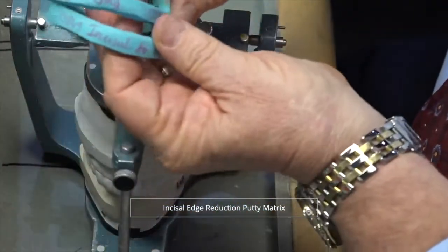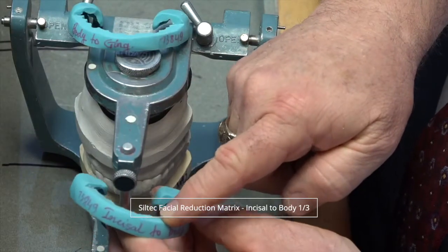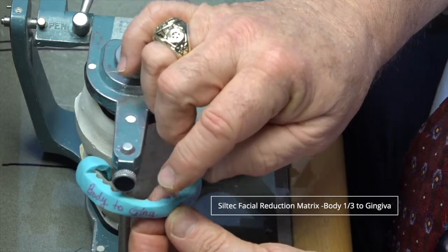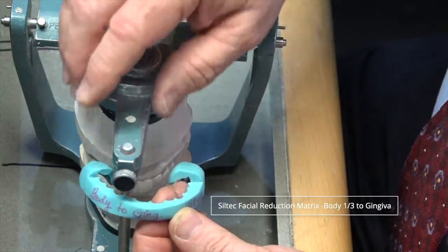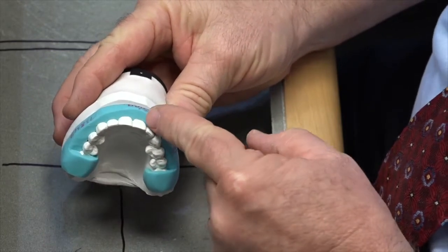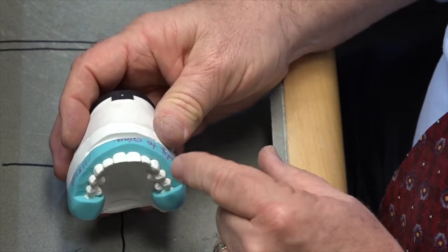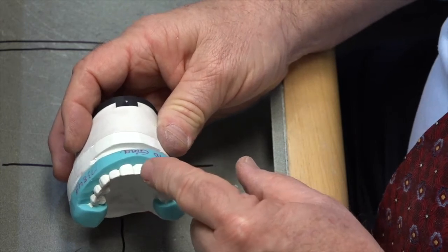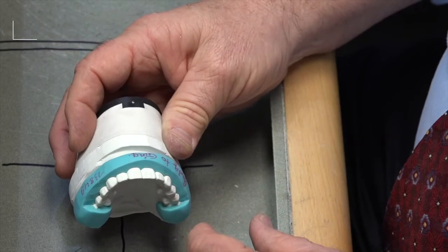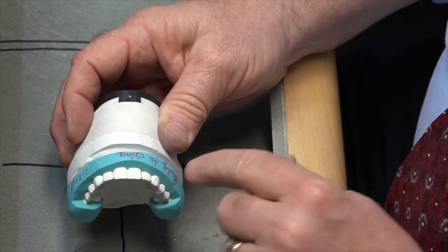Then we make two putty matrices for facial reduction. One is cut back on the line between the body third and the incisal third, and the second is cut on the junction between the body third and the gingival third. That way the doctor can put these putty matrices in the mouth and make sure they've got uniform reduction in relation to our diagnostic wax-up. They hang on the molars since we're going from second bicuspid to second bicuspid. The biggest thing this is good for is making sure that the points in the facial interproximals — the facial embrasure points of the matrix — are pointing between the preps.